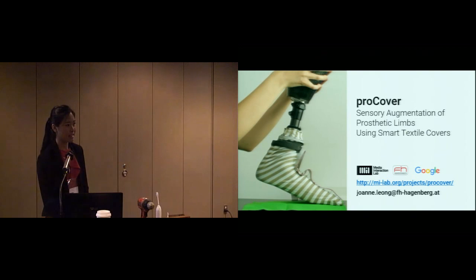Yeah, we actually considered different places to put the fabric, for example, outside of the shoe versus inside of the shoe. One of our main considerations was how they fit into people's routines. As these users already wear socks regularly, that was a motivation for us to take this kind of approach. But it would definitely be interesting to study the differences between outerwear versus innerwear for the sensor.